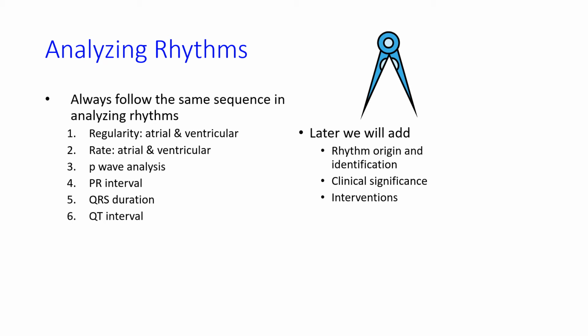When you do your homework, you will compare what you're doing to the back of the book. And again, if you find that you are off by a lot, usually don't worry about one box or so, but if you're off by a lot, it might just be where you're measuring. So contact your educator or your mentor or your preceptor and have them work with you so that you can make sure that you're measuring correctly.